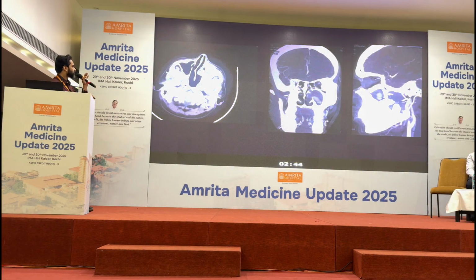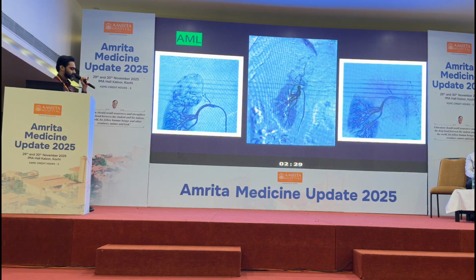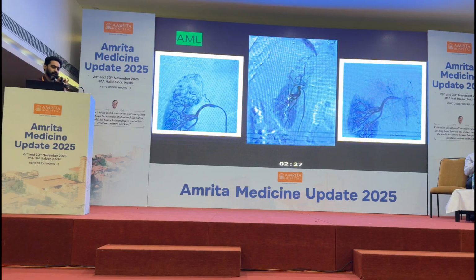This is a patient with polytrauma. He had an aneurysm in his maxillary sinus, and for this we got into his left internal maxillary artery and embolized that with glue. This is another patient who has a large mass in the upper pole of the right kidney.